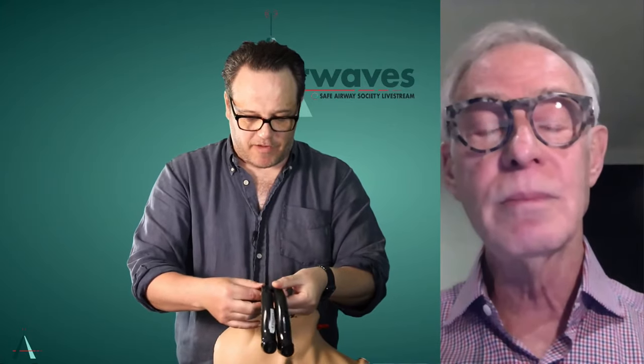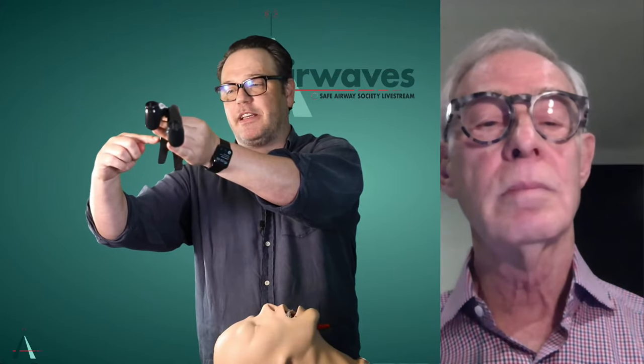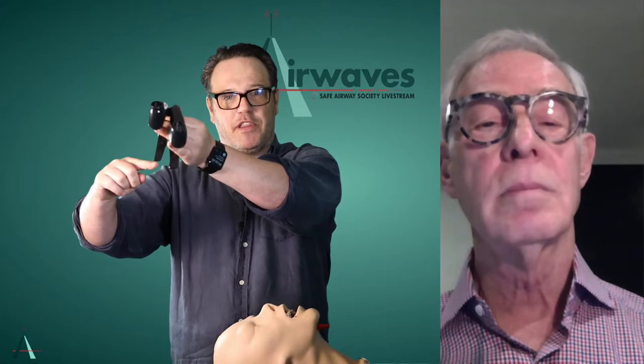I think that's interesting, because I was saying to you yesterday that I've been using the 4, but I haven't really been able to work out why. And nearly everyone I know who's expert with this has recommended the 3. And that last point you made really made the difference. I've lined those two blades up here so that the cameras are at the same level. The camera to tip distance is much longer with the 4 than with the 3, and that camera to tip part of the GlideScope blade is flat.